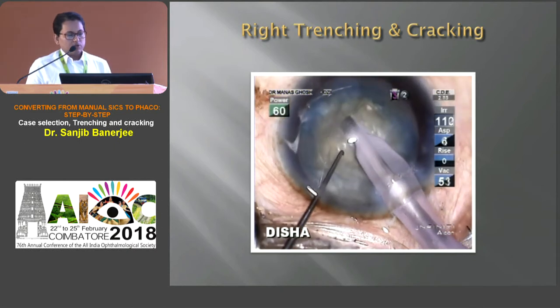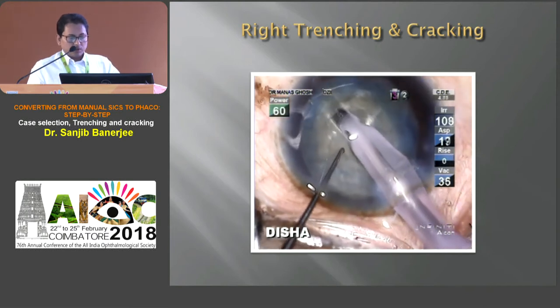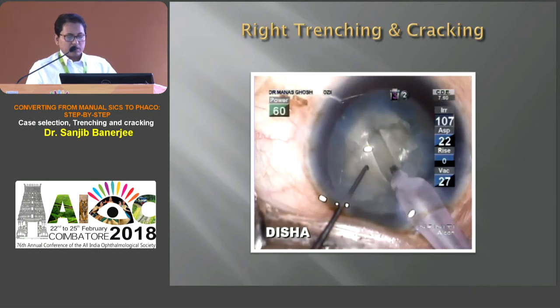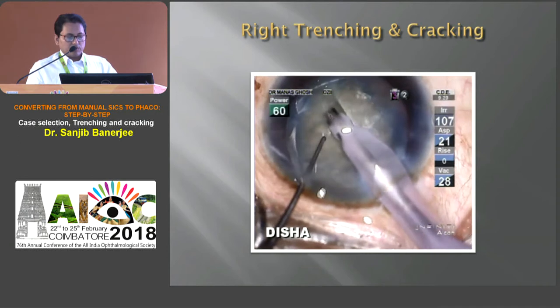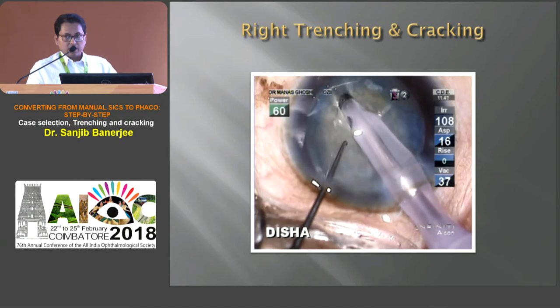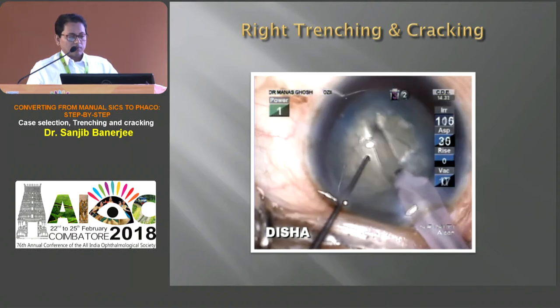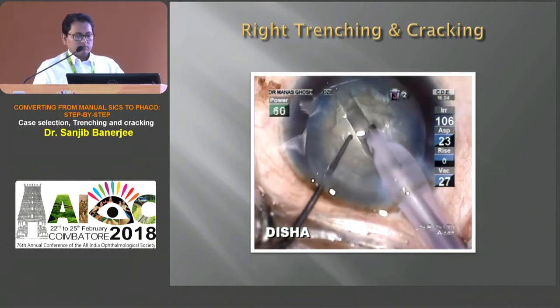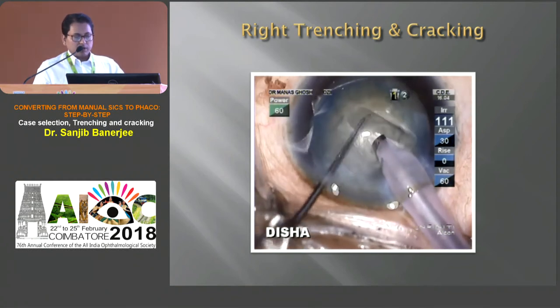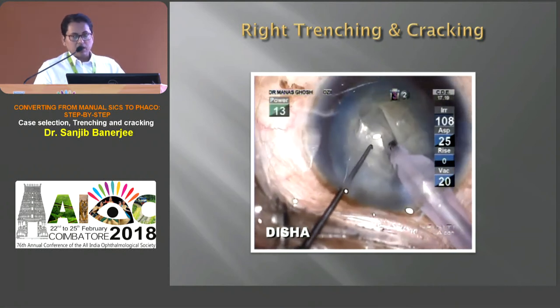This video demonstrates how to do right trenching and cracking. The trenching is started from the 12 o'clock position, just in front of the rhexis margin, and stops just in front of the rhexis margin at 6 o'clock. One-third of the phaco needle tip should be engaged during trenching, and the width of the tunnel should be one and a half times the width of the phaco needle. When one side is completed, the nucleus is rotated 180 degrees and the same trenching is done on the other side.